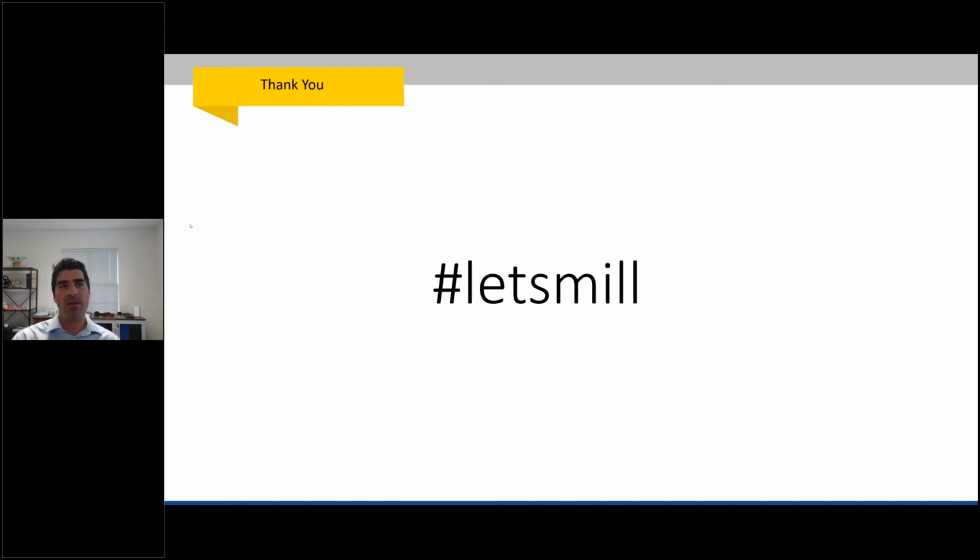Half the reason why you stay up to date is to just get the enhancements, to make sure you're running as smoothly and as efficiently as possible. And probably the other half is really to make sure you get those bug fixes and make sure your software doesn't get out of sync. But the new features and that sort of thing, we're on pace. We do usually about one new feature every single month.